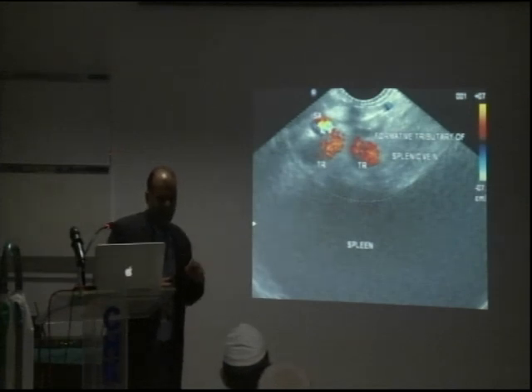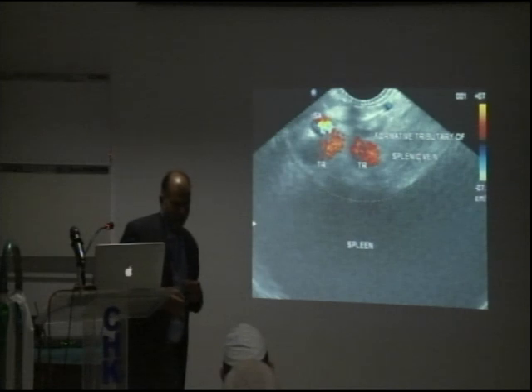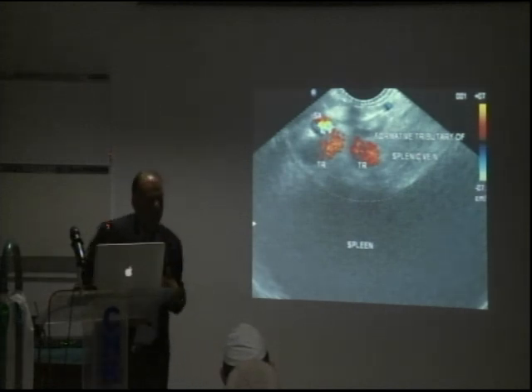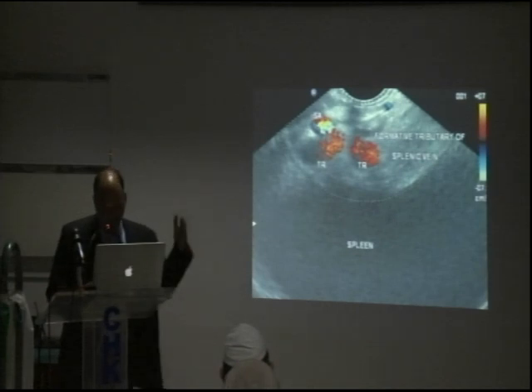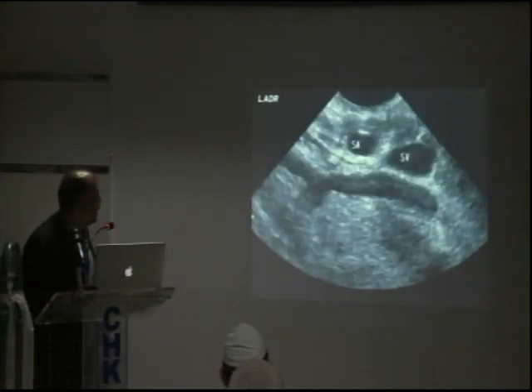You getting it? Interrupt me if not. So this is what it is. In the stomach, if you rotate towards right, there you go. Left, then it's, yes, there you go. So you're getting there. All right.